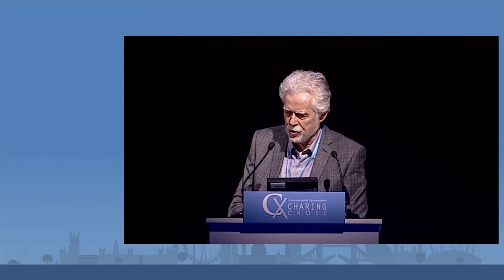But what I want to stress, if you want to use it, it's very important to really keep very strictly to the parameters. Because if you do a hand injection, or the foot is moved, or you use low density contrast, your signal will not be reliable. So it's very, very meticulous how you do it. But if you do it in a meticulous way, we've done more than 150 patients now, and you will really see that it's a stable way to do this. It's just another way of thinking about CLI. It's more dynamic. It's functional imaging. Thank you very much.